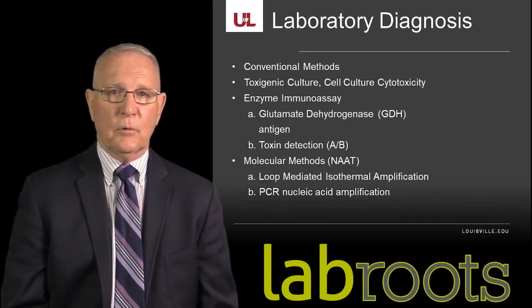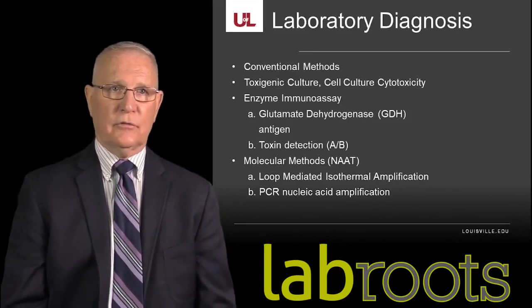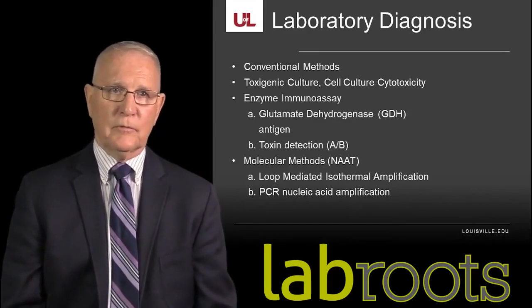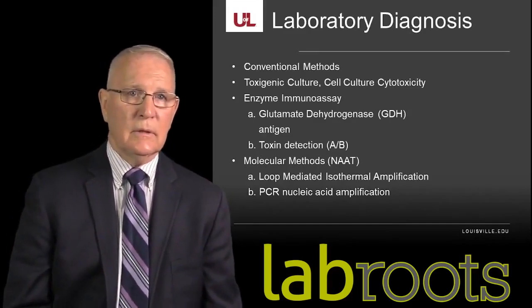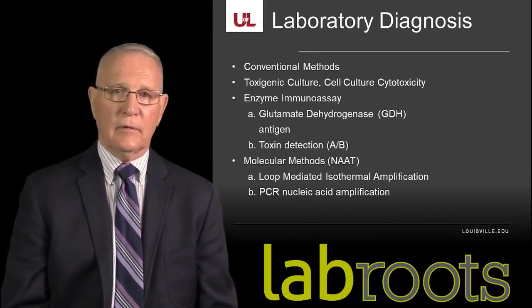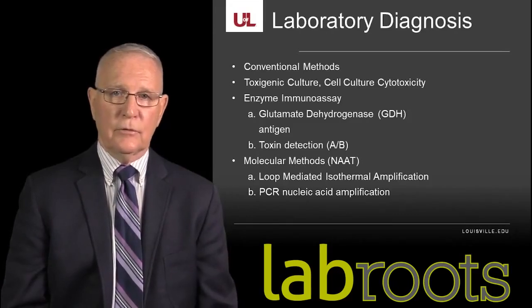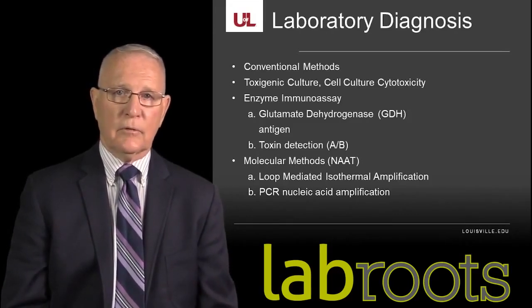So when we come to the point of laboratory diagnosis, we have a couple of options available to us in the form of conventional methods or molecular. And of course, molecular technology is becoming widely used in the laboratory diagnosis of a variety of infectious diseases.